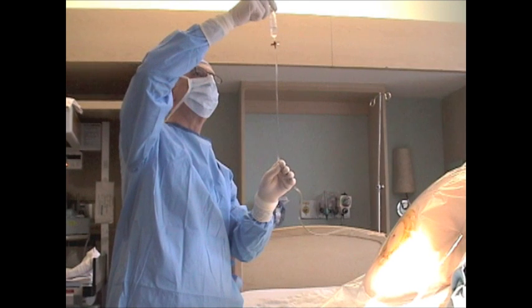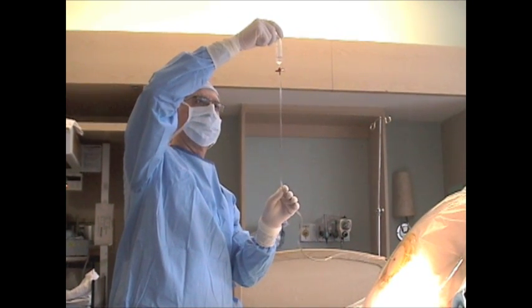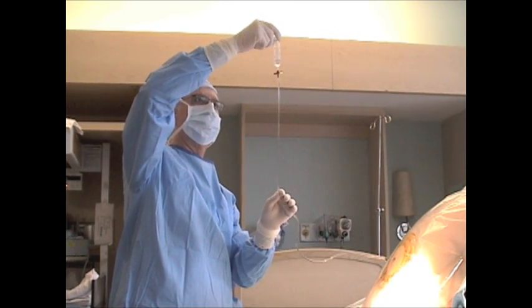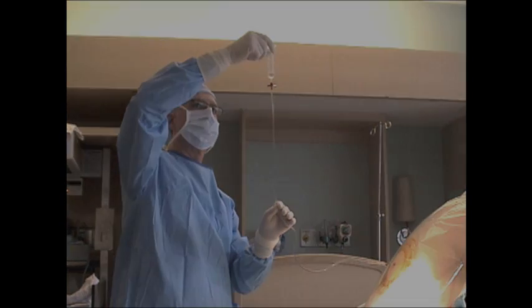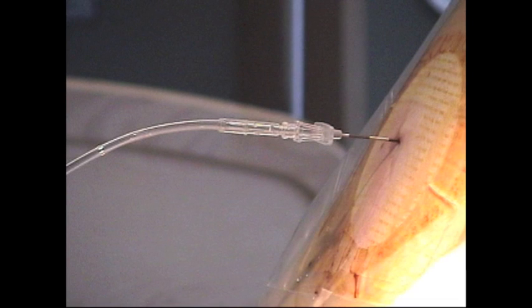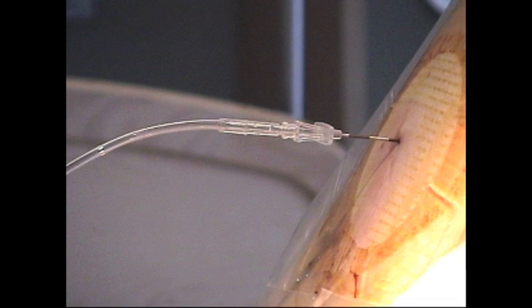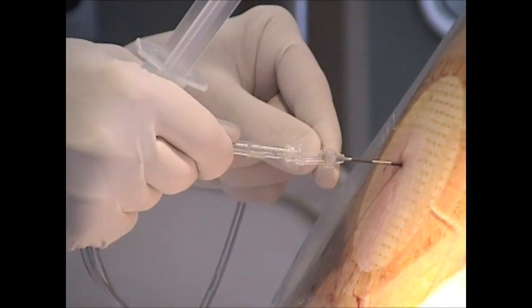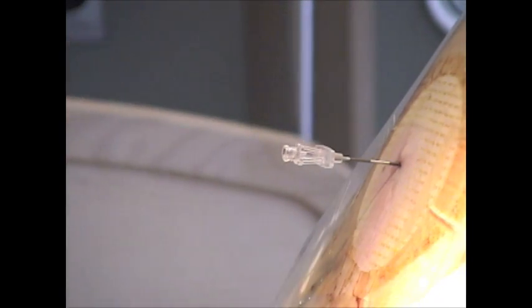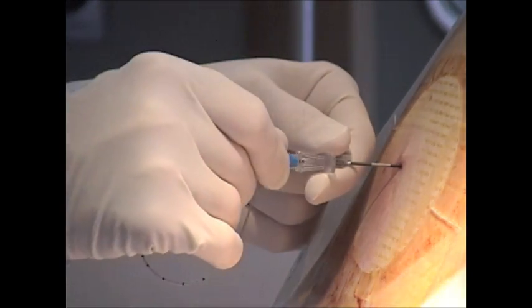If fluid fluctuations are noted, the reservoir is held at an elevated position so that the desired volume of fluid can be delivered into the epidural space. After the anesthetic solution has drained into the epidural space, the tip of the extension tubing is removed from the hub of the epidural needle, and the epidural catheter is threaded in the usual manner.